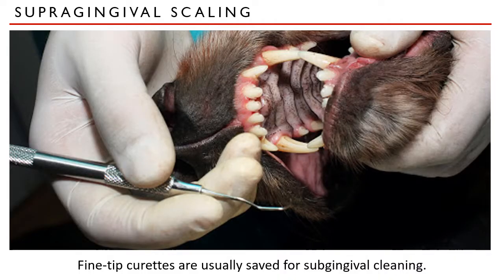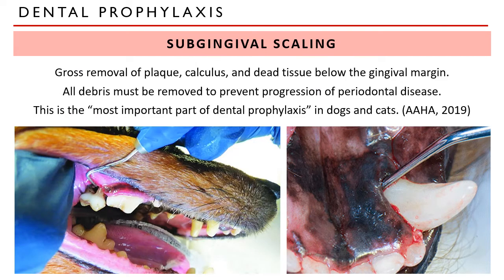The manual curettes with fine tips, as seen in this image, are usually saved for subgingival cleaning and for the lateral surfaces of the teeth. After removing the plaque, calculus, and dead tissue above the gingival margin, we now proceed to do the same thing below the gingival margin. All debris must be removed to prevent progression of periodontal disease, and this process is said to be the most important part of dental prophylaxis in dogs and cats, according to the dental guidelines published by the American Association of Animal Hospitals.